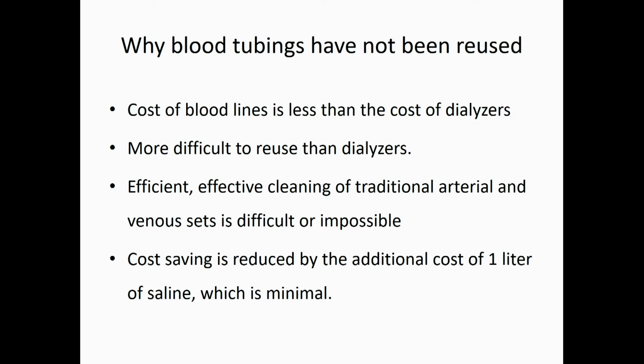So how much will I save? 50 rupees. And plus I'll have the risk of having rigors in the unit. And what is the cost of my time to go and attend to the rigors? So it is not worthwhile reusing blood tubing.